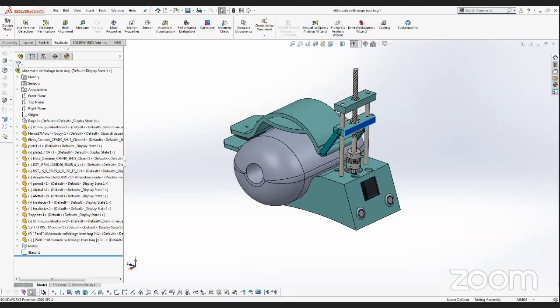Okay, so hello, I'm a designer. Normally I design mechanical machines and I have put up a small suggestion for a design that is shared on GrabCAD also, so everybody can take this and modify. Basically the idea is to have a simple device that can mechanically actuate the ambu bags. And the idea is to use common parts, so this design can be replicated in developing countries or similar places. So it uses a high helix screw bar and common parts for an FDM machine like the stepper motor and Arduino and controls. And yes, it's a very simple design.